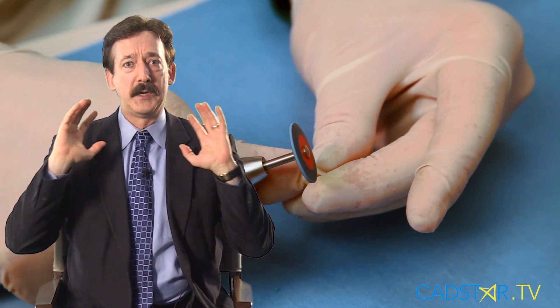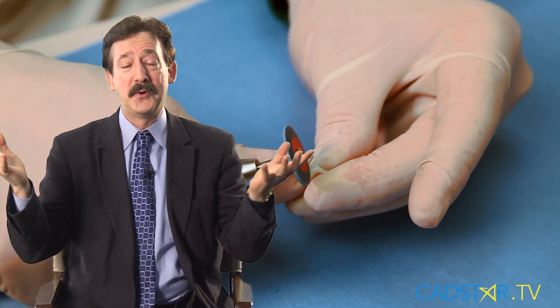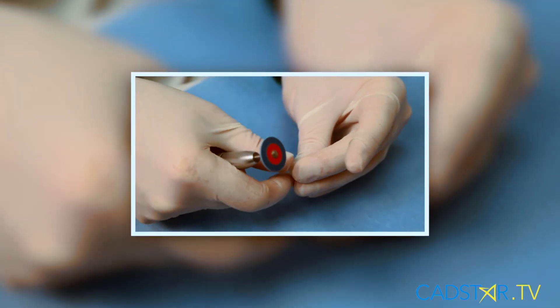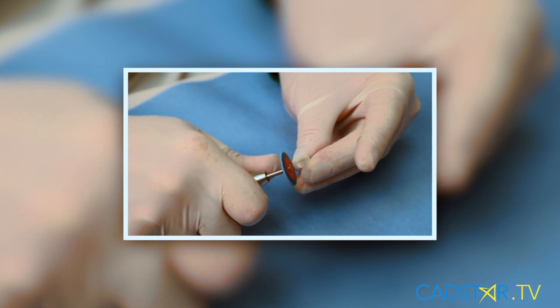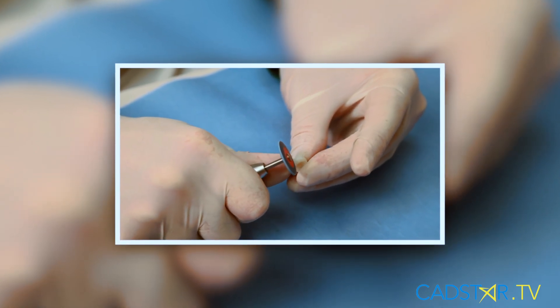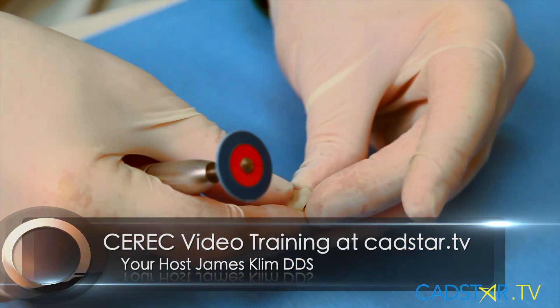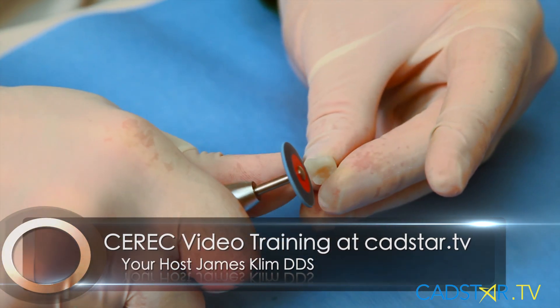Some clinicians like it a little firm so they can customize it in — that's fine. In my clinical theater, I like to just place them down and not have to customize them, maybe just a little firm for some finishing. How you finish your proximal contact restoration also depends on the firmness you want. I like mine to pop down with just a little firmness.